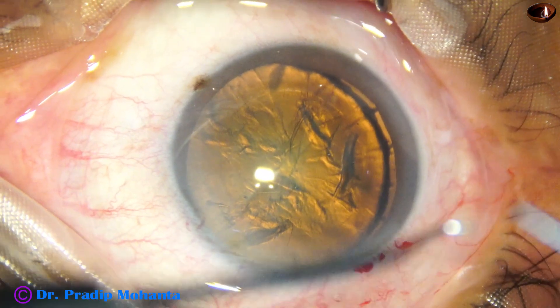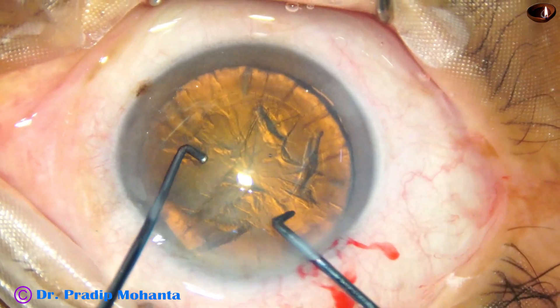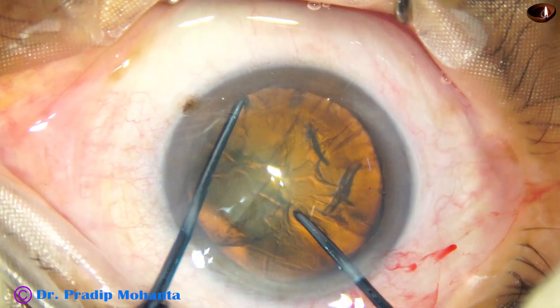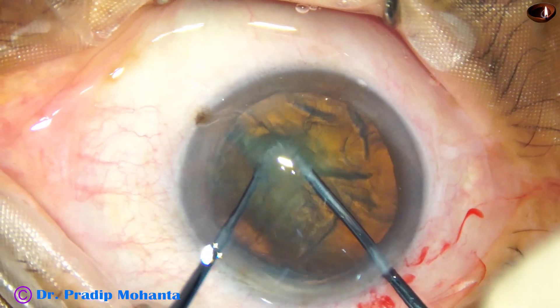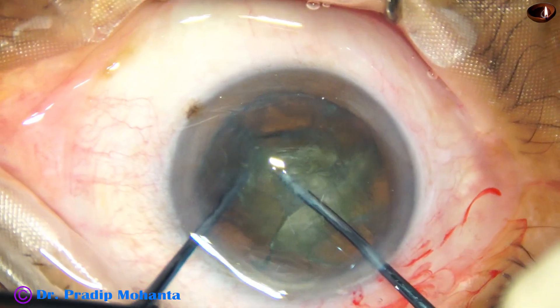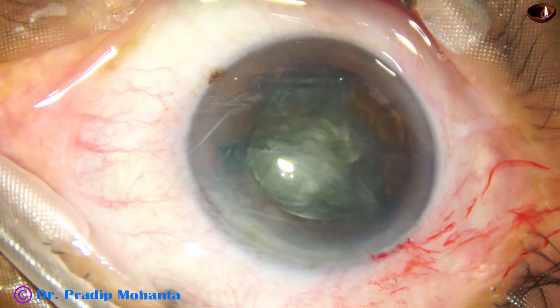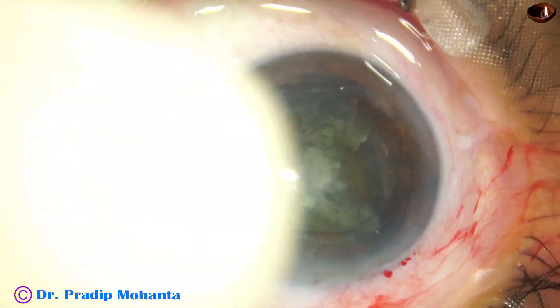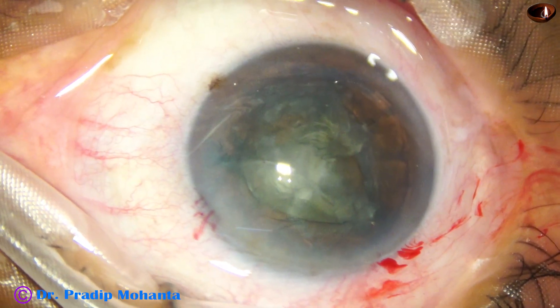If I rotate many times there will be a problem in visibility. So here goes the pre-chopper — it engages just in front of the rhexis margin near the main wound and the opposite equator is hooked. In this case the left hand instrument did not go to proper depth, so the crack happened but it is not nice. Now second attempt — this time it went to proper depth, and so the nucleus sustainer tip has to be depressed so that the ball tip goes to the posterior surface of the periphery of the lens.